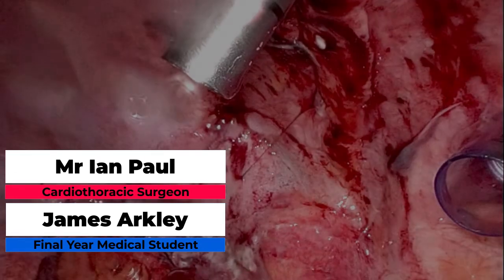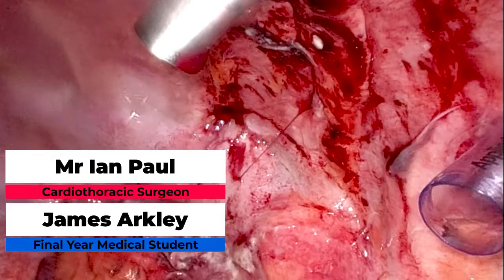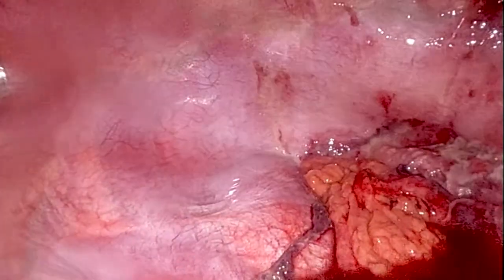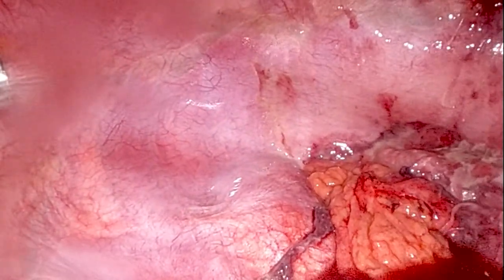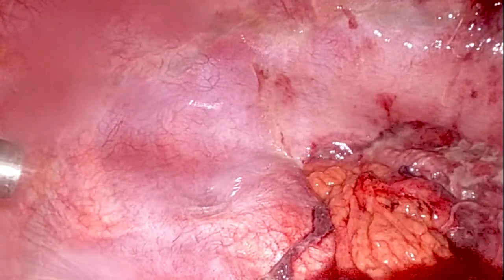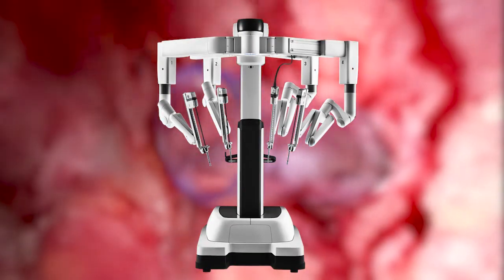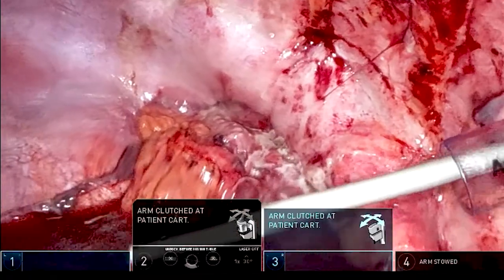This operation was performed by Mr Ian Paul, one of the thoracic surgeons at James Cook University Hospital. I'm James, a final year medical student. We're using a three-port approach — one port on the left, one on the right, and a port through the middle for the camera. We're using a DaVinci XI robot, brand new at James Cook, costing about £1.5 million, with each case costing between £1,000 and £15,000.